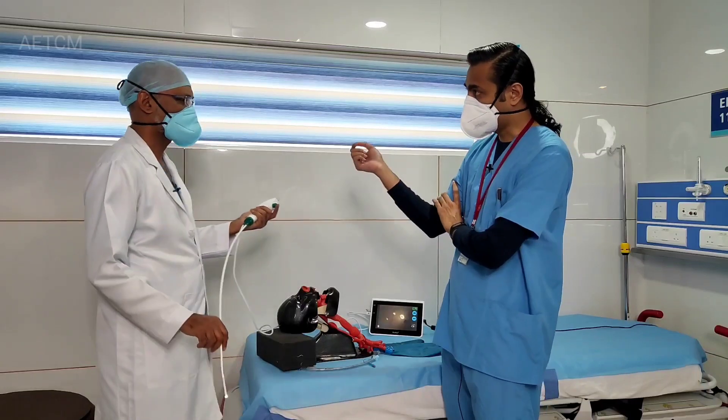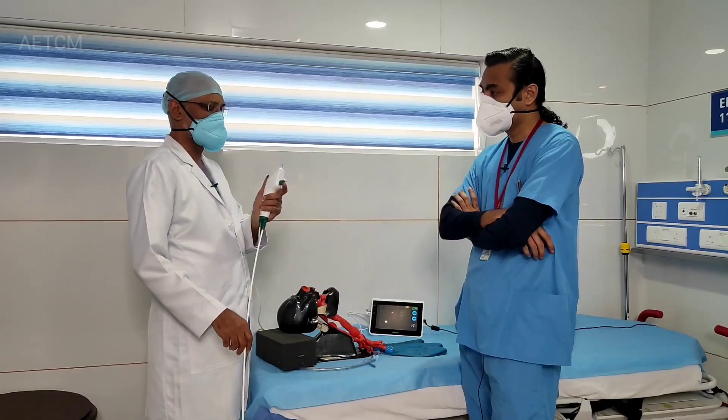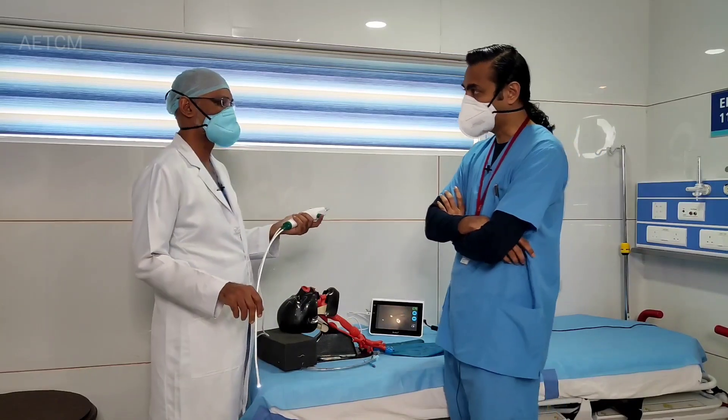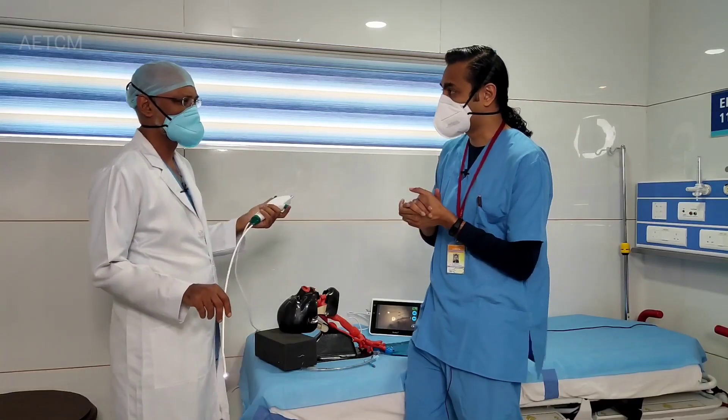So even forceps and other things can be introduced through that channel. You can put forceps through and maybe take small bronchial biopsies like the pulmonologist does. But we will limit our discussion not to pulmonological interventions, but more from an emergency and critical care point of view.